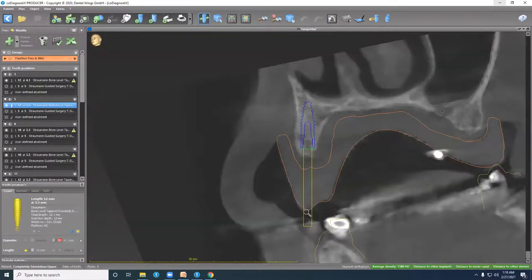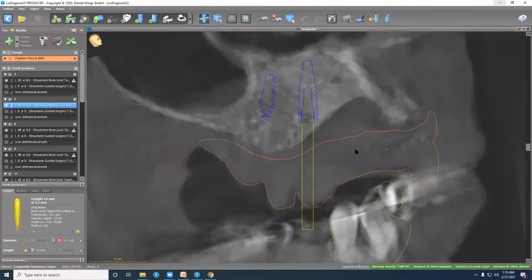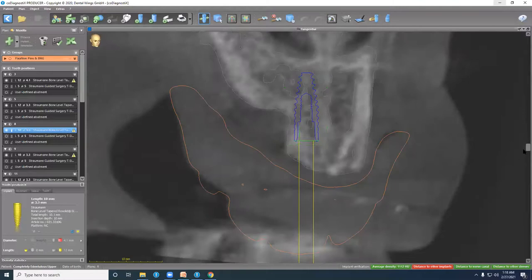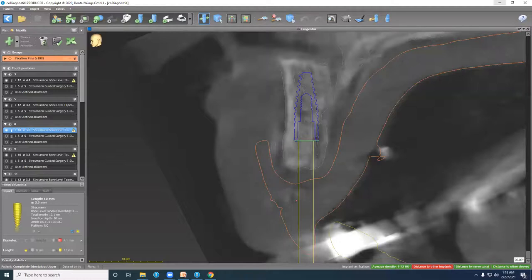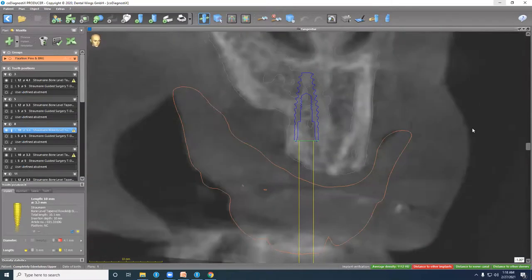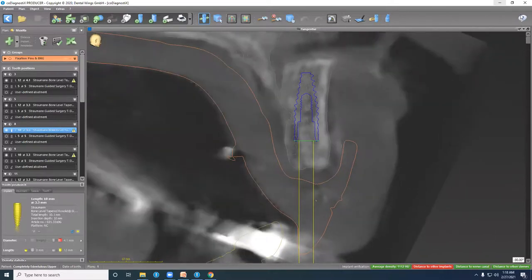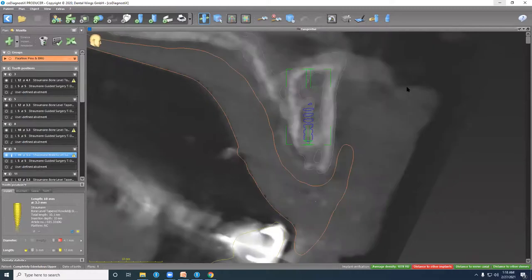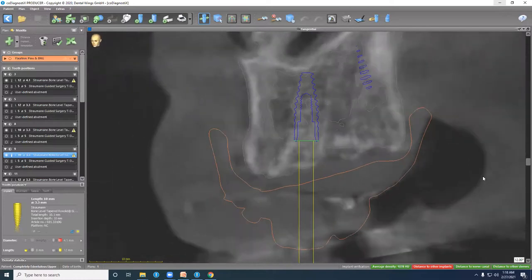If you look at the implant trajectory, you might notice that it's inclined to the facial aspect. And we'll look into this in a minute. For the two anterior implants, I have a 3.3 by 10 placed at site number 8. As we notice, it's as close as we can get to the nasopalatine without perforating through it. And its distal aspect will be exposed into the defect. Number 9 implant is the same size, 3.3 by 10, also engaging the nasopalatine.